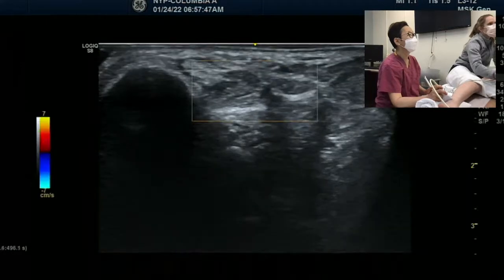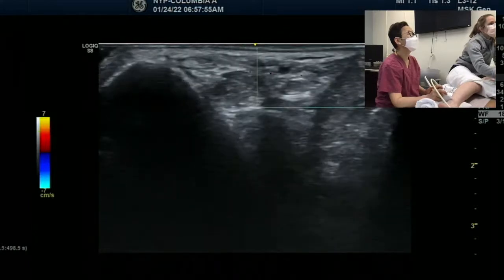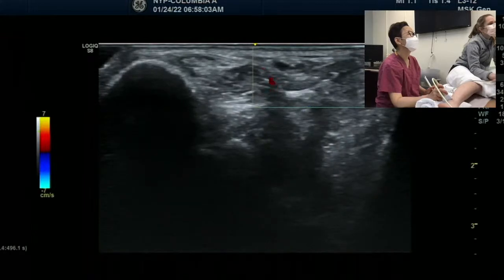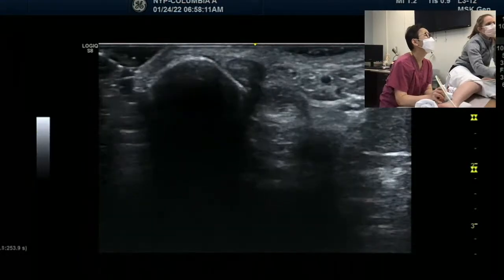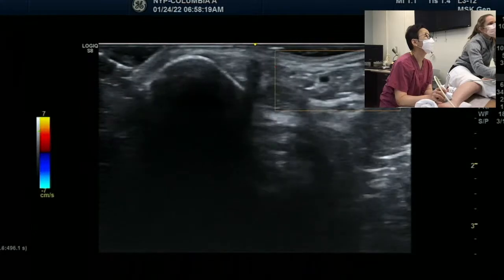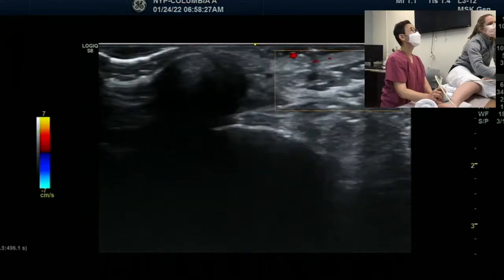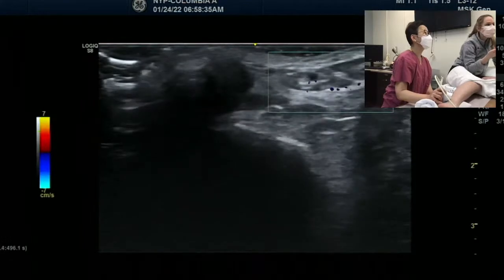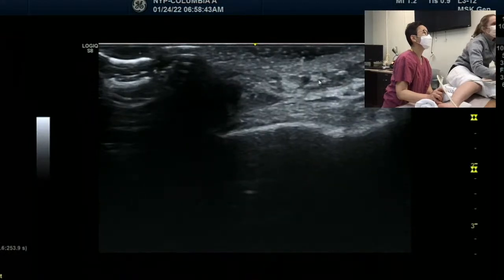So if you look at it like this, can you put the color flow on? Go a little more up. Let's turn it off for a second. Around there, right? So the small saphenous vein is over there. We try to see the color from there. Interestingly, nothing is popping out. When I was doing this with my Butterfly last night, there was no color flow either. But I think that's it, right in the middle. And next to it, next to the whitish one here, is the sural nerve. That's the sural nerve.